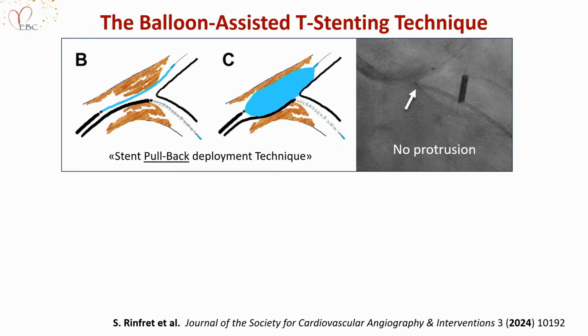It's Rinfret, who is a famous CTO operator. He is also from Canada. In 2024, he presented this paper. And this is the same. It's the balloon-assisted pullback deployment technique.